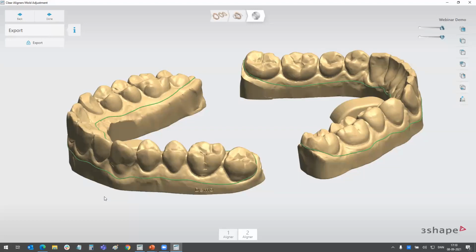And then we have a question: can orthodontic offices who have an in-house lab with milling machines have the auto cut line feature? If they are in the US, the FDA still has a requirement that the lab is FDA registered, and that imposes a lot of QA workflows and self-control, where they have to say, yes, today I have checked that this and that is in order, and do quality assurance, and there's a lot of paperwork that kicks in.